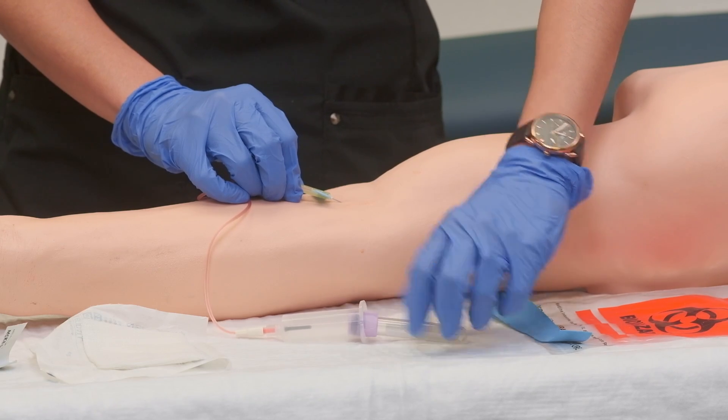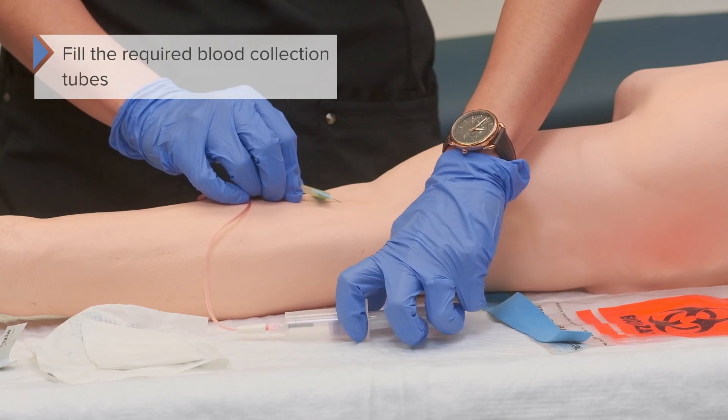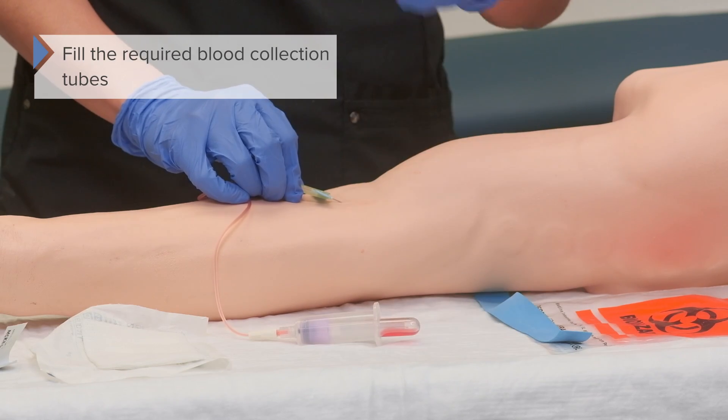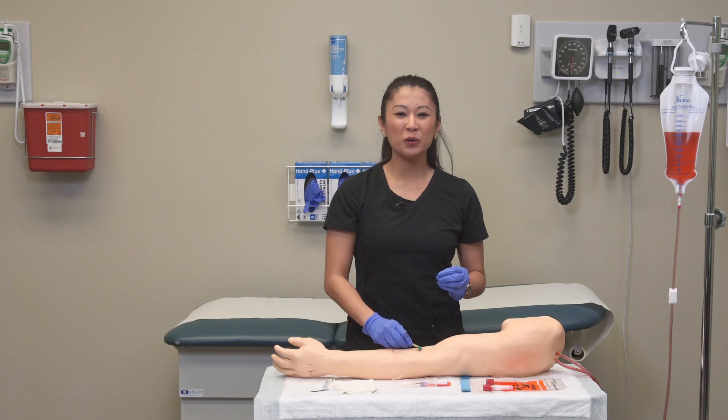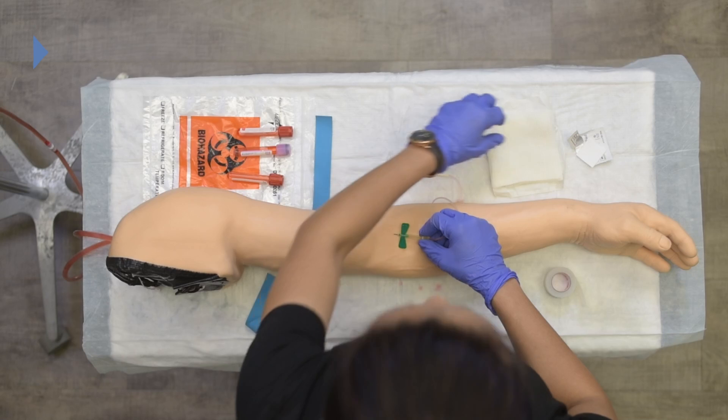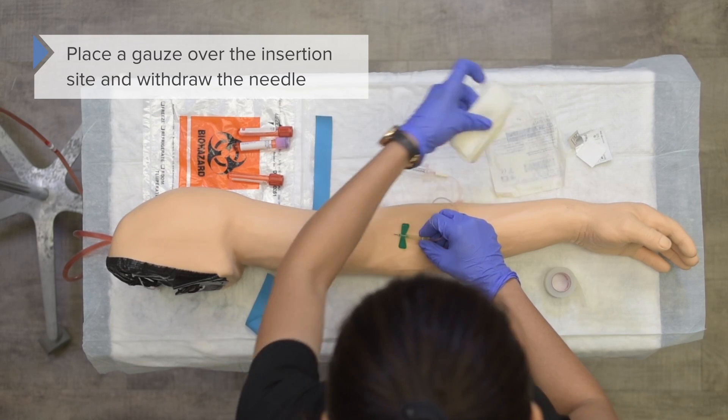Stick the collection tube in, push it all the way until it punctures, and make sure it fills appropriately. Once we've got our blood collection tubes filled, we can remove them and place the gauze over the insertion site.